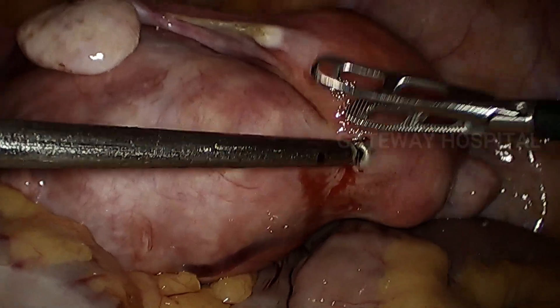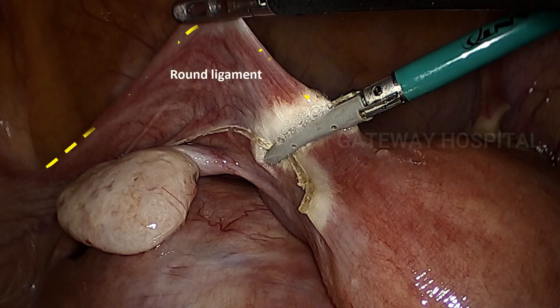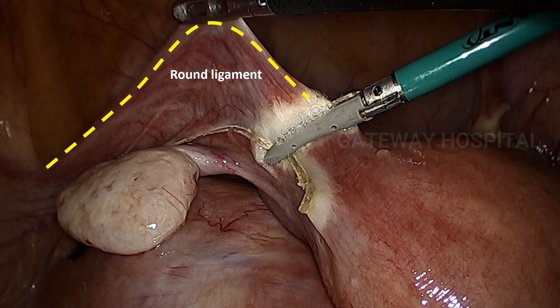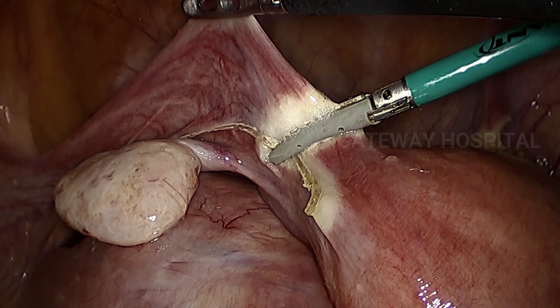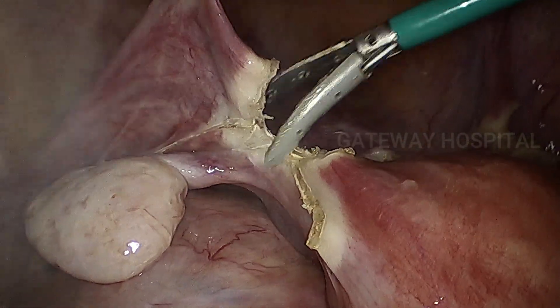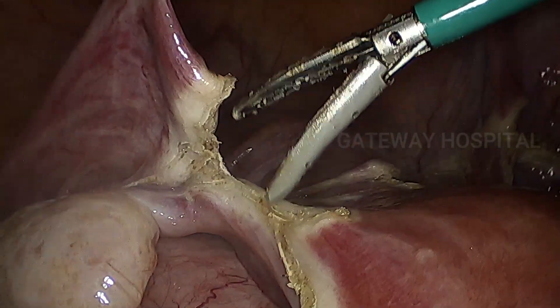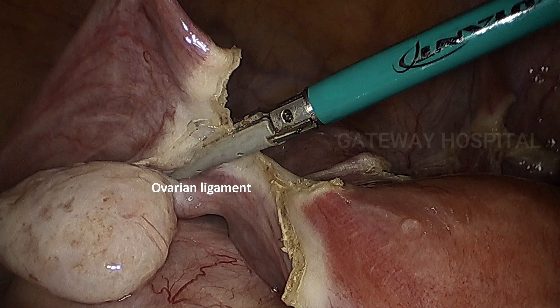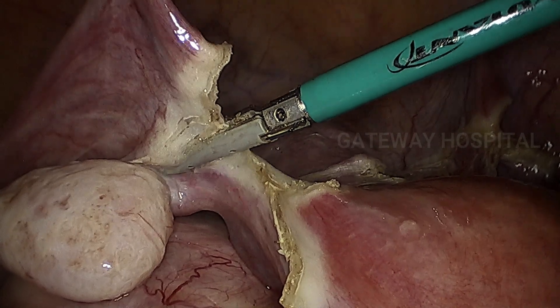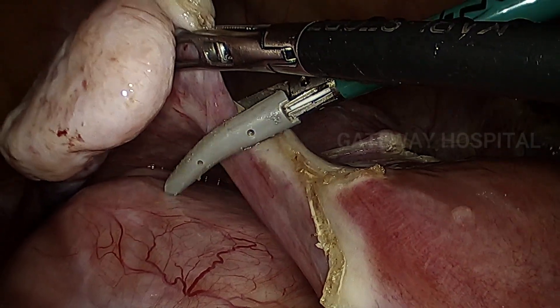Now we are turning our attention towards the left round ligament, which is being sealed and divided by using the Voyant system. You can appreciate the anatomy of the left round ligament. Just beyond this is the ovarian ligament, which attaches the ovary to the uterus. You can see a large fibroid sitting behind the ovarian ligament, occupying the entire pelvis. After dividing the ovarian ligament, we are going towards the left broad ligament.